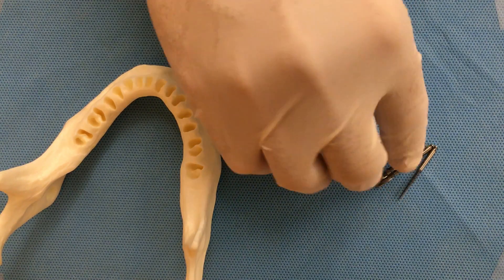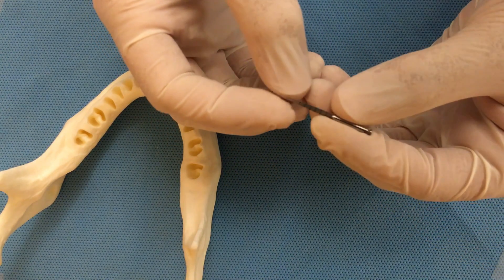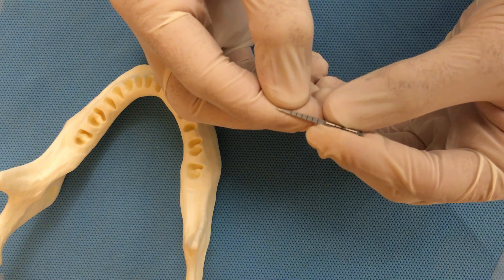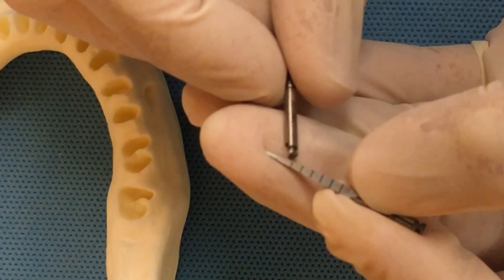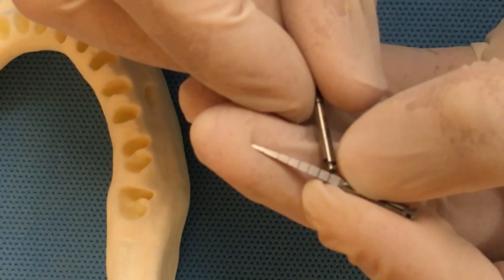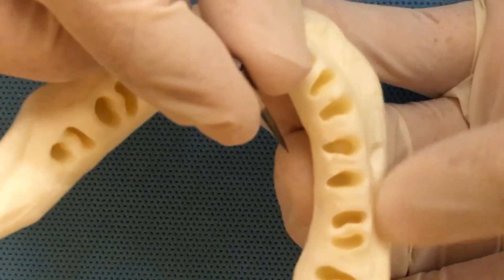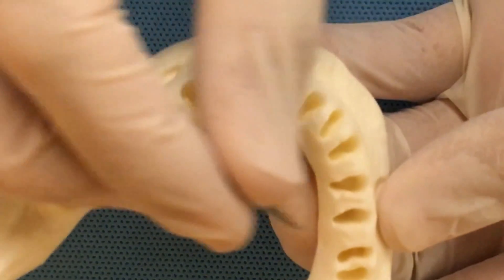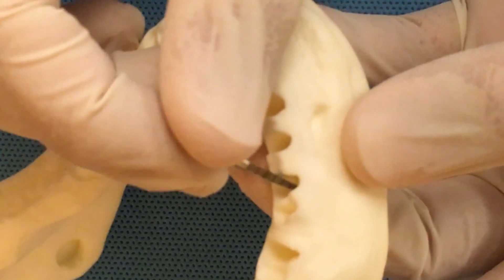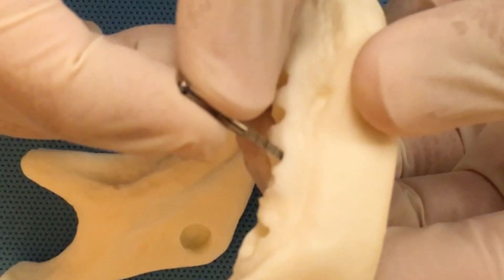We're going to start with the initial drill. When we look at the lengths of the drill, we have the first apical line at 6 millimeters, then 6, 8, 10, 12, 14, 16. This is the extraction socket and we want to measure, right after the extraction, how deep the root of the molar is.